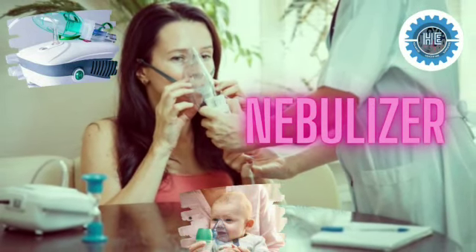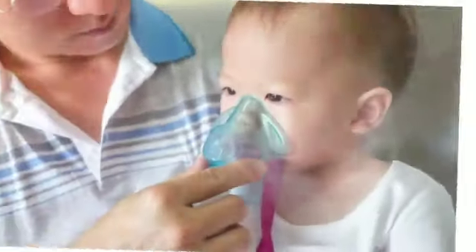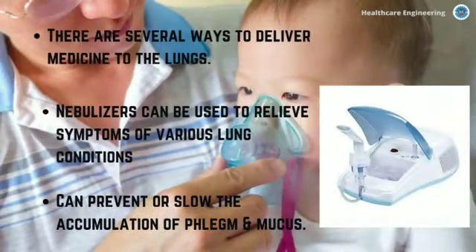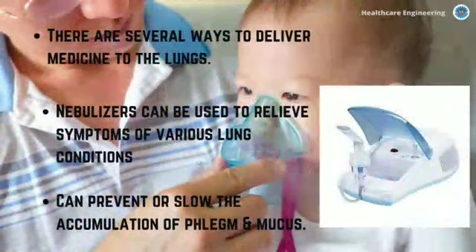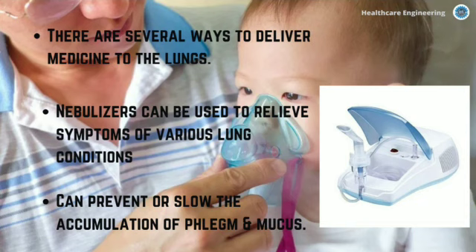In today's video, we are going to talk about nebulizers. There are several ways to deliver medicine to the lungs, such as inhalers. Nebulizers are another type of drug delivery device that turns the medicine into a fine mist that is breathed in. Nebulizers can be used to relieve symptoms of various lung conditions by administering both quick relief medicines and long-term control medicines. Most inhaled medications relieve symptoms such as wheeziness, breathlessness, and tightness in the chest.